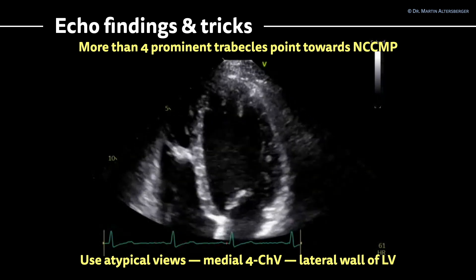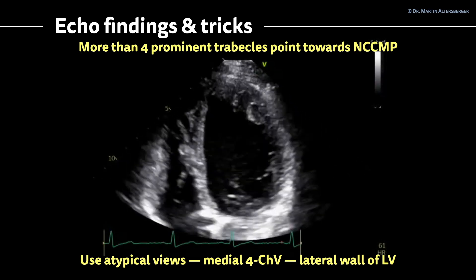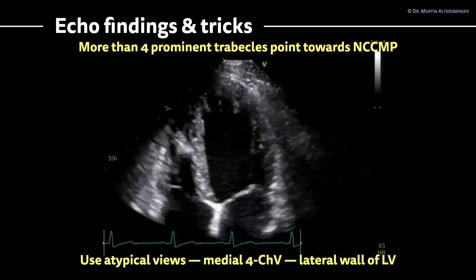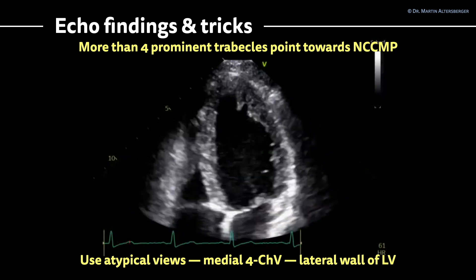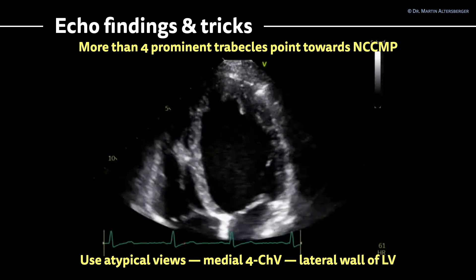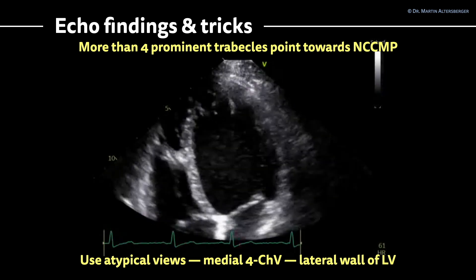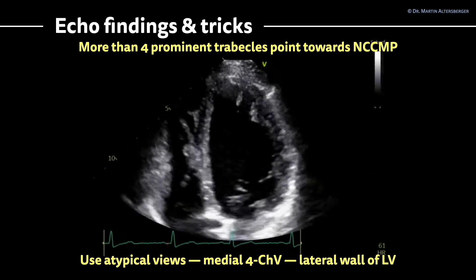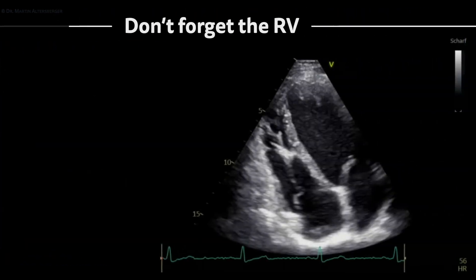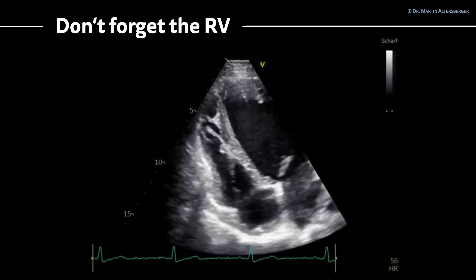Especially in young patients with reduced left ventricular ejection fraction, use atypical views. Move the transducer more medially in an apical four-chamber view to better display the lateral wall of the left ventricle. This helps optimize Doppler alignment and better visualize trabeculations or pathologies of the lateral wall in apical imaging.